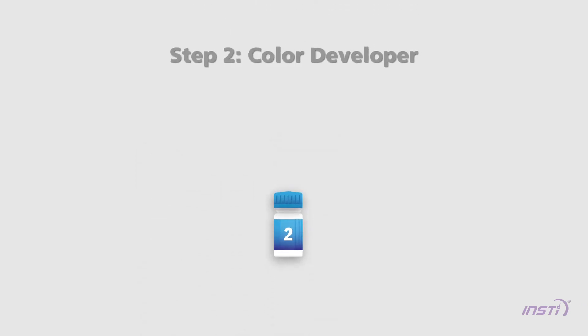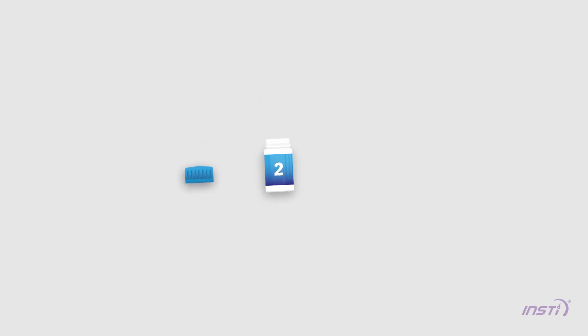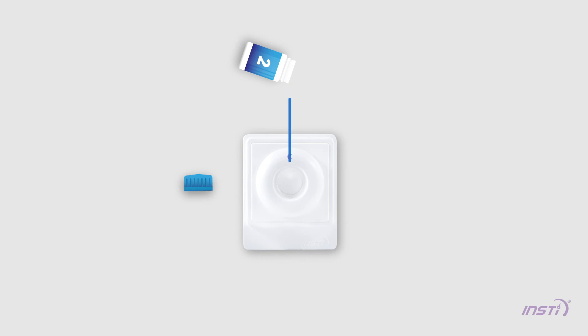Step 2 — Color developer. Shake Bottle 2 four times and pour all the liquid into the membrane unit. You may need to gently tap Bottle 2 to get all the liquid out.